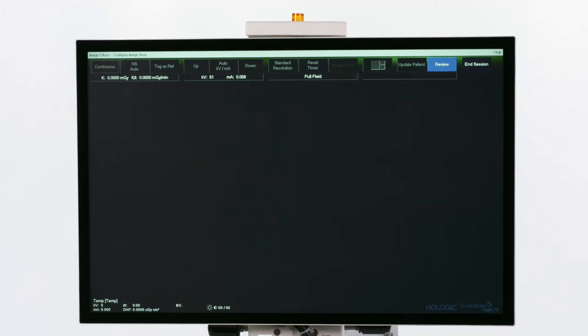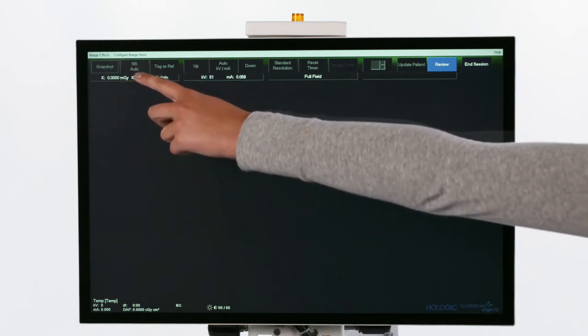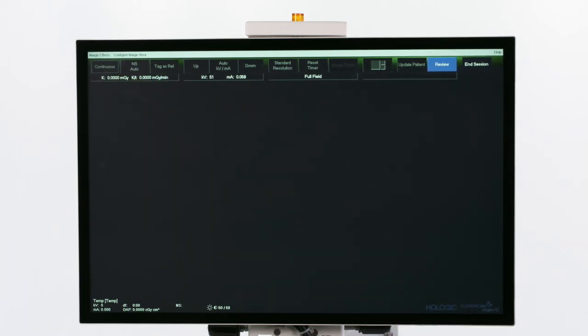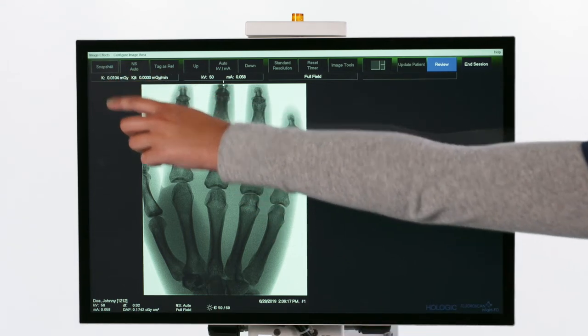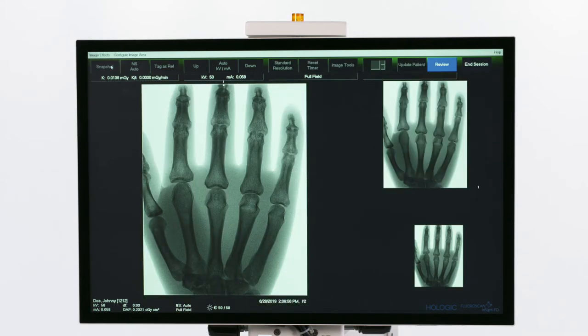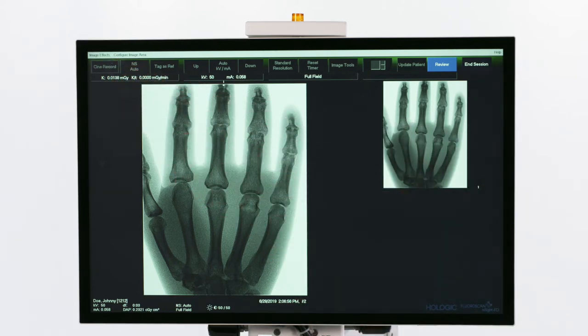To toggle between the image acquisition modes, press the Continuous, Snapshot, or Cine Mode button. When acquiring images in Continuous mode, X-rays cease as soon as the X-ray button or pedal is released. When in Snapshot mode, one image is captured and displayed when the X-rays are actuated. Cine Record gathers all images acquired in a Cine Loop.